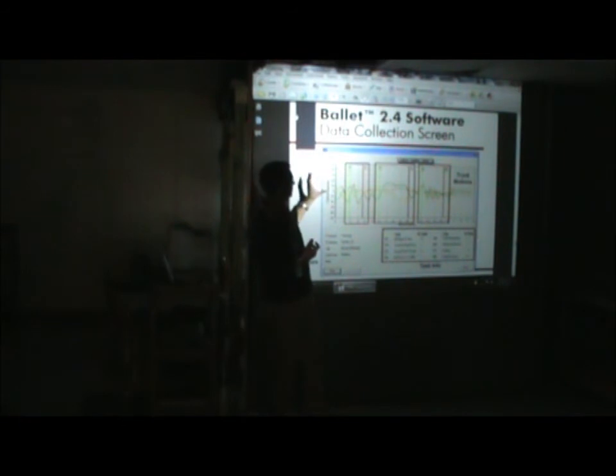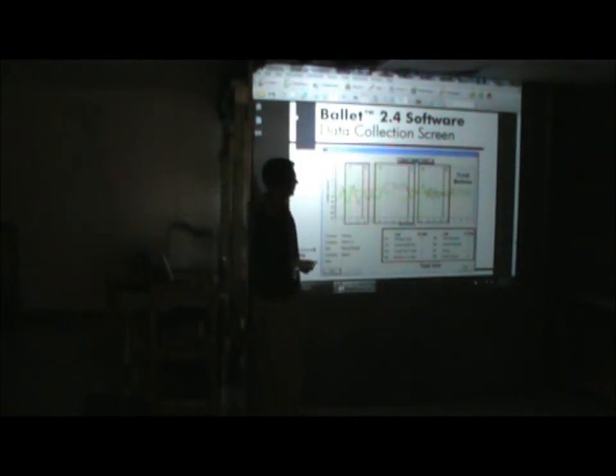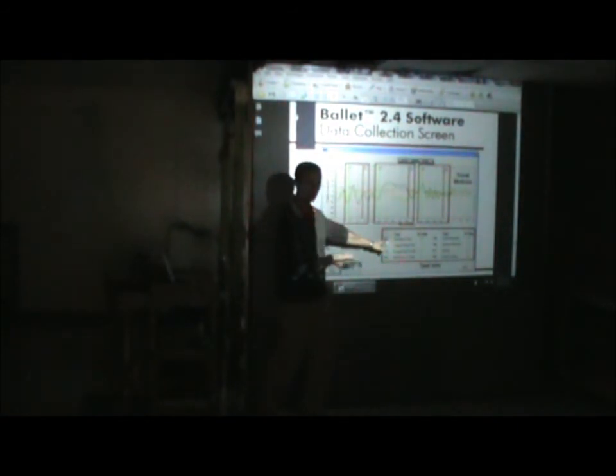This is the motion data that you can actually look at. It's tracking lateral, sagittal, as well as twist, and you can see this on the screen when you're collecting data. And then you have your hotkeys, your function keys, to break it up into different tasks. If you hit F1, it'll start collecting for task 1.